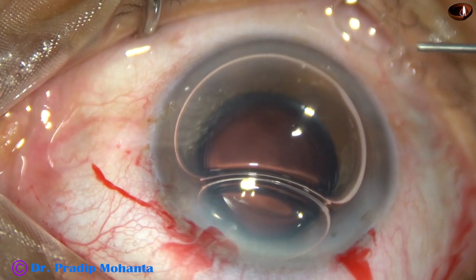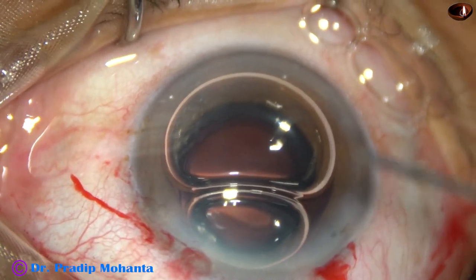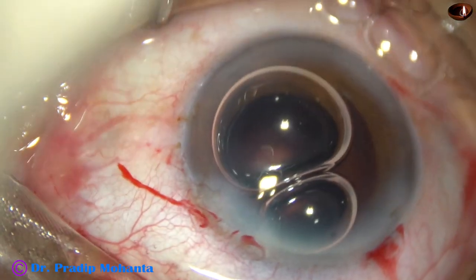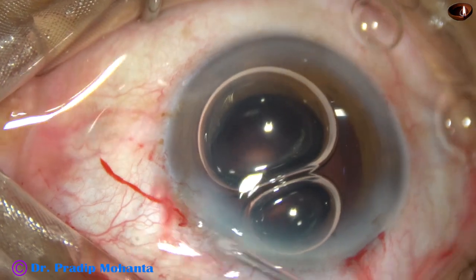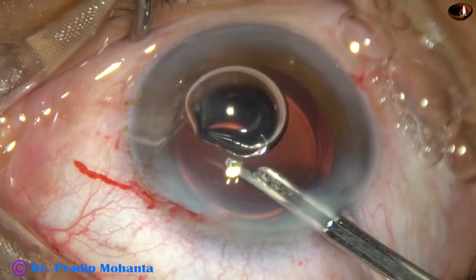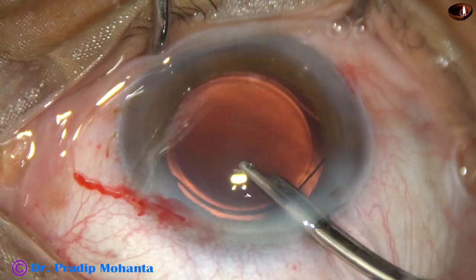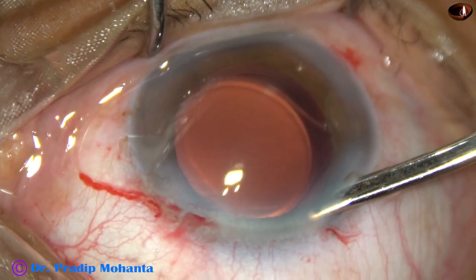So we must always ensure complete removal. In this case, the anterior chamber became very shallow, so an air bubble has been used to keep the anterior chamber formed and close the side ports. The side ports are being closed by hydrating corneal stroma on either side of these step wounds. Now, final lavage of the anterior chamber — a 23-gauge Simcoe is taken and the anterior chamber is lavaged. The capsular bag is also irrigated once, and then the anterior chamber is formed very nicely. The case is concluded.